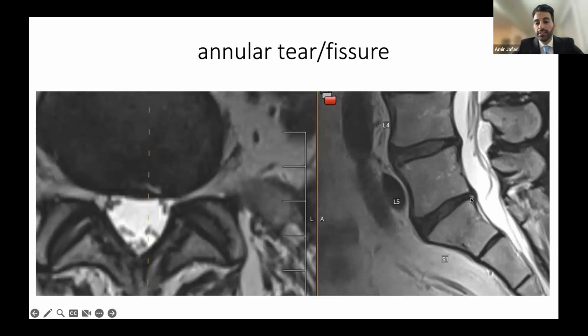So I look at this and I see this annular tear. Obviously, this guy's in a lot of pain. I think he's an elderly patient. He kept coming back, so there's something going on there. I see there's an annular tear here, lighting up here, a disc bulge with annular tear. Some people with annular tear, it's very painful, so you can't discount it.